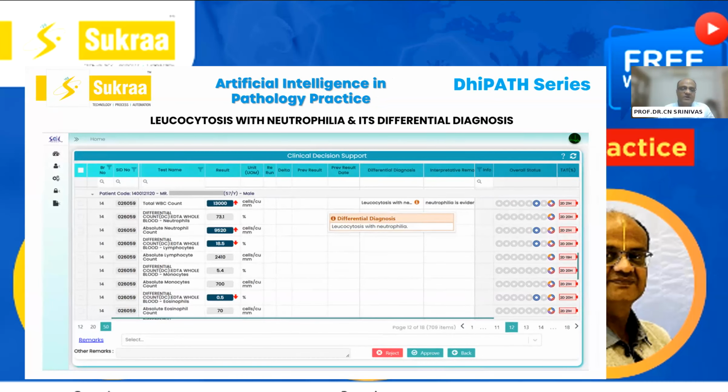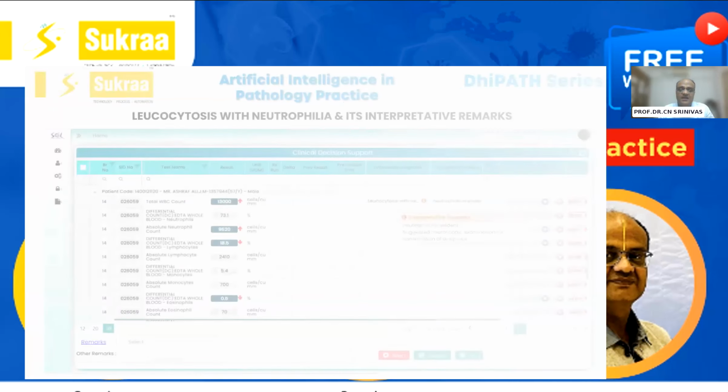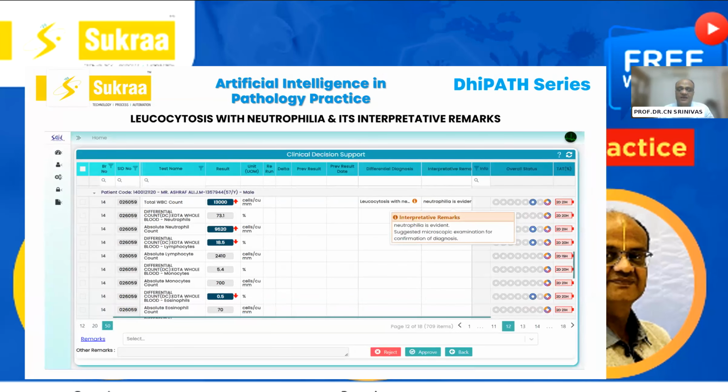Now we have one more case where the WBC count is very high with neutrophilia. If you see here, the WBC count is high, with an arrow mark showing that it is high. The absolute neutrophil count is high, and the differential count shows the lymphocytes to be low. It also indicates leukocytosis with neutrophilia. And let's see the interpretive remark. It says very clearly that neutrophilia is evident, suggested microscopic examination for confirmation.